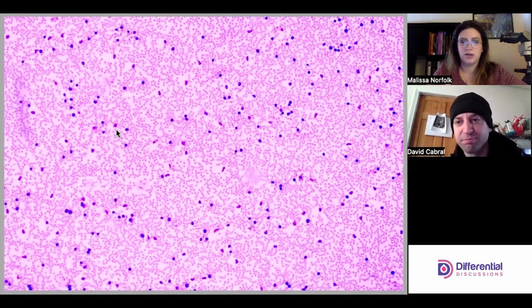You're going to have a majority of lymphs, these mononuclear cells, or prolymphs, depending on the patient, and then all the smudge cells. Now, what we can do is use an albumin prep to get rid of the smudge cells.